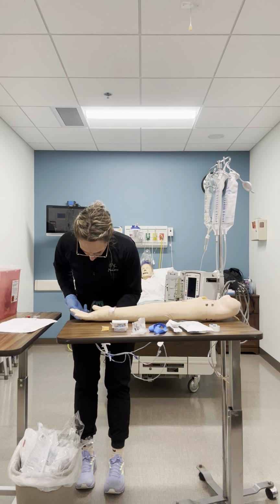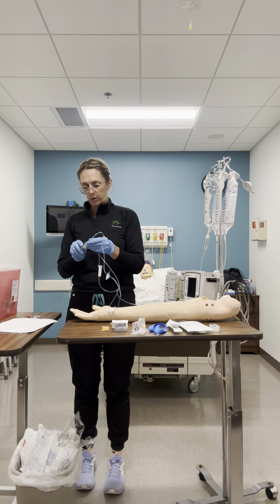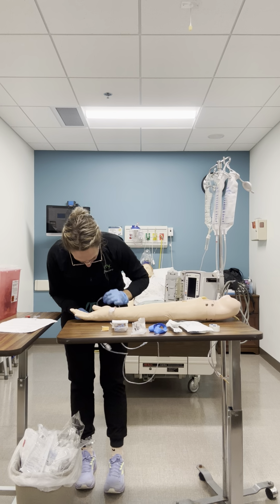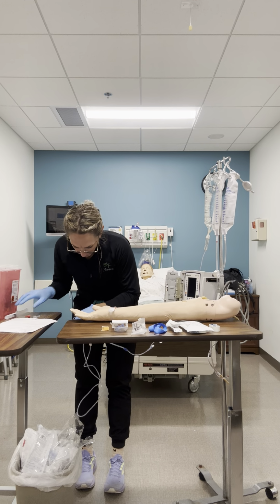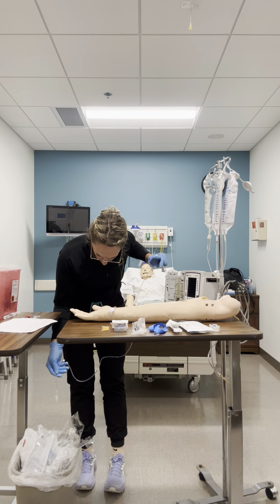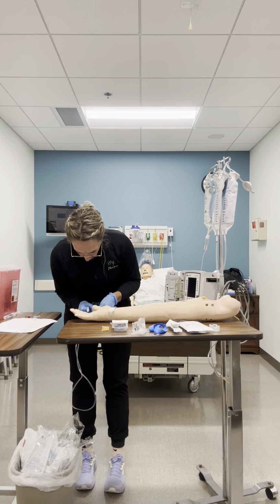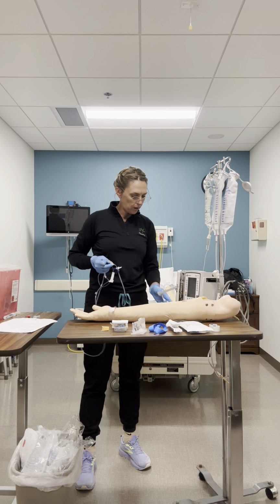So I'm getting my tubing primed, and it's like there's an air bubble in there, so I'm just kind of pulling. There it goes. Okay. So I'm getting my tubing primed. Making sure I'm not wasting any. Set the lid on, and I've gotten the saline through the tubing. Got my cassette closed again.